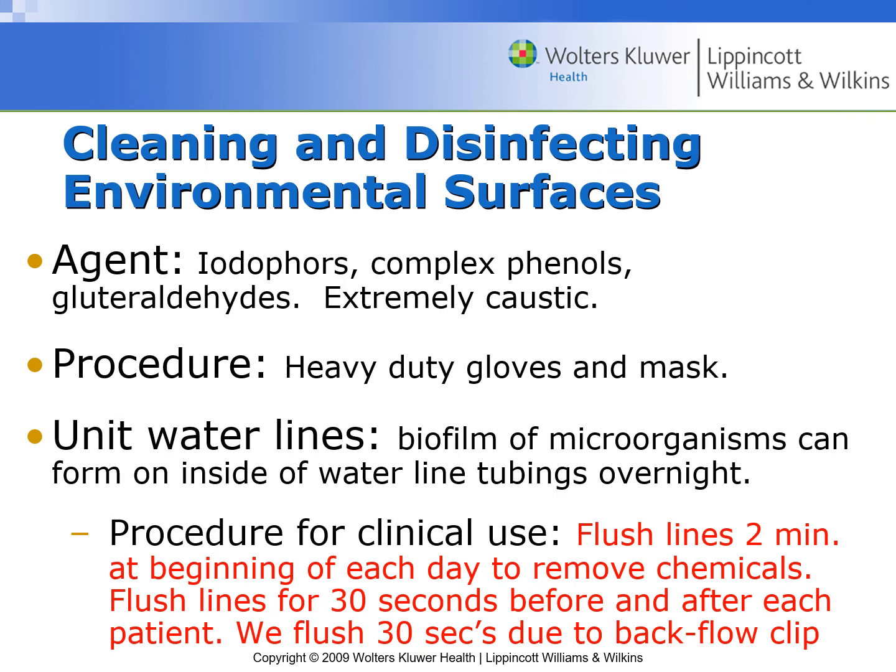If you don't have a backflow clip, a backup of all of that can happen, and have a backflow of those microorganisms and everything inside of the tubing. So the backflow clips are very inexpensive. If you don't have one, you are not supposed to have your patient use a suction method with their mouth on that suction tip. But we do happen to have them, and since we do have them, we only need to flush our lines for 30 seconds due to the backflow clip.